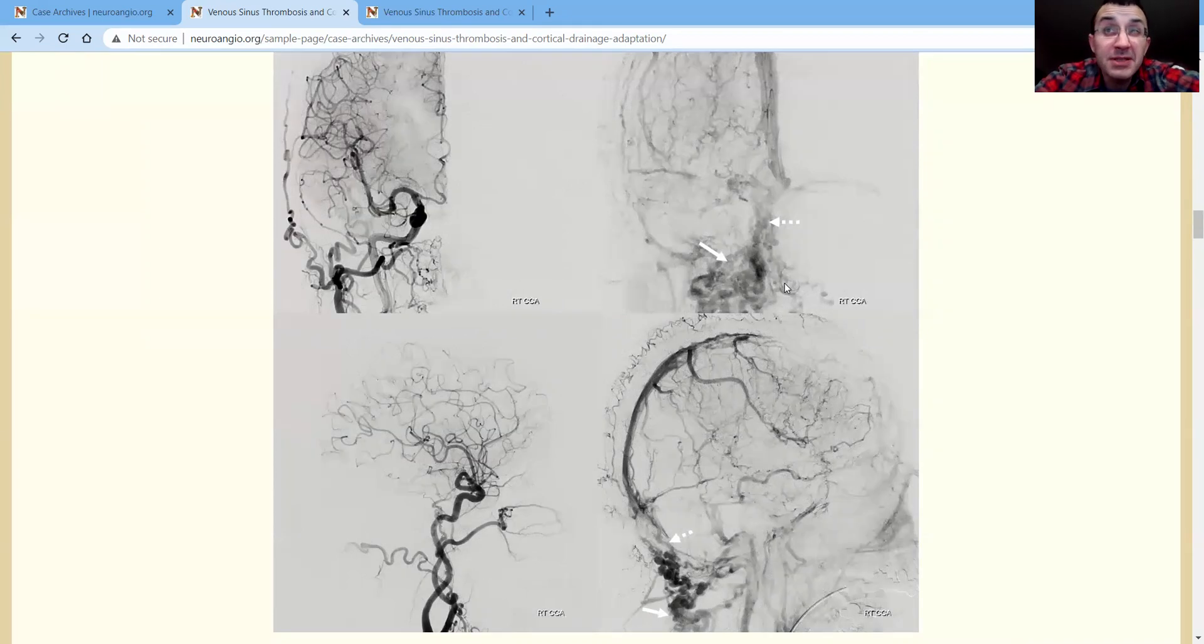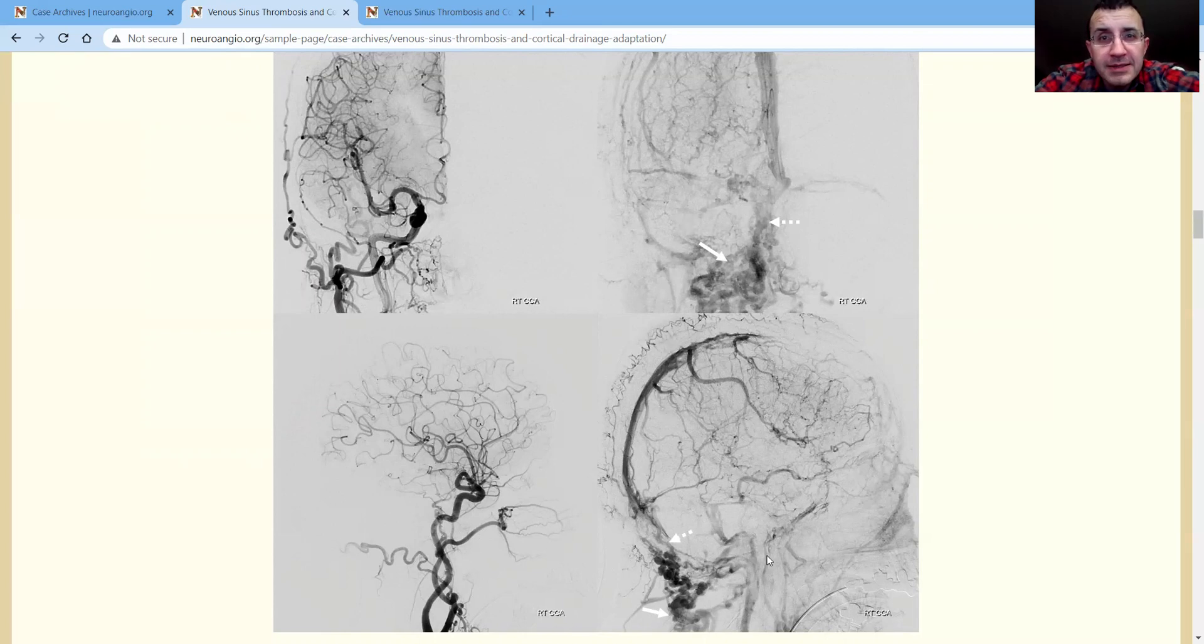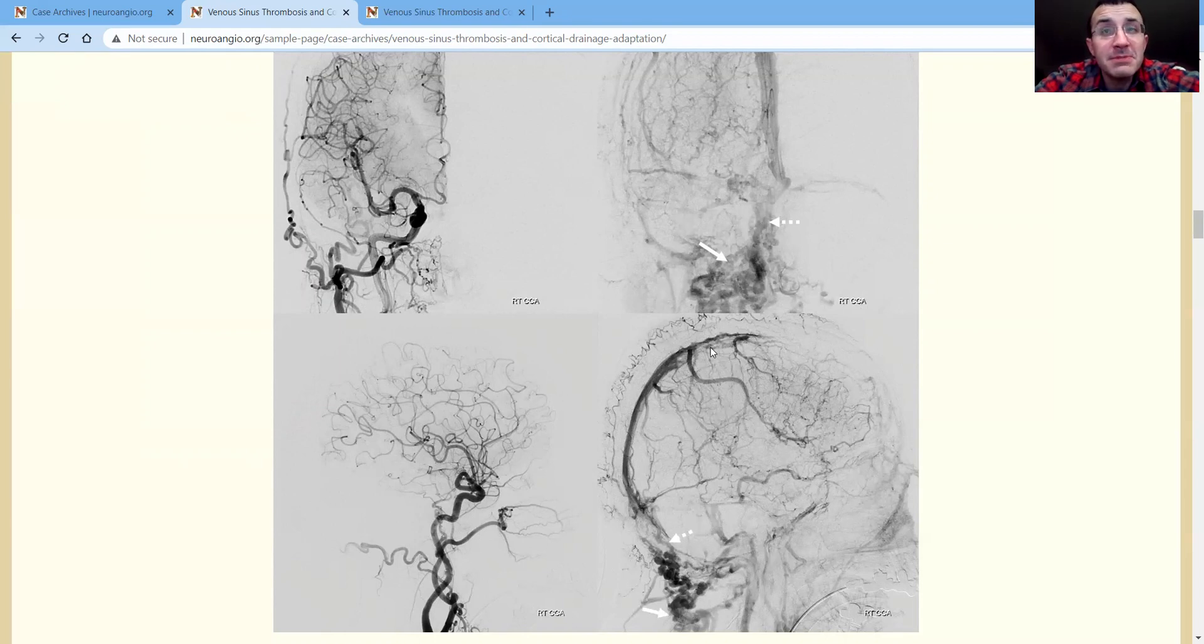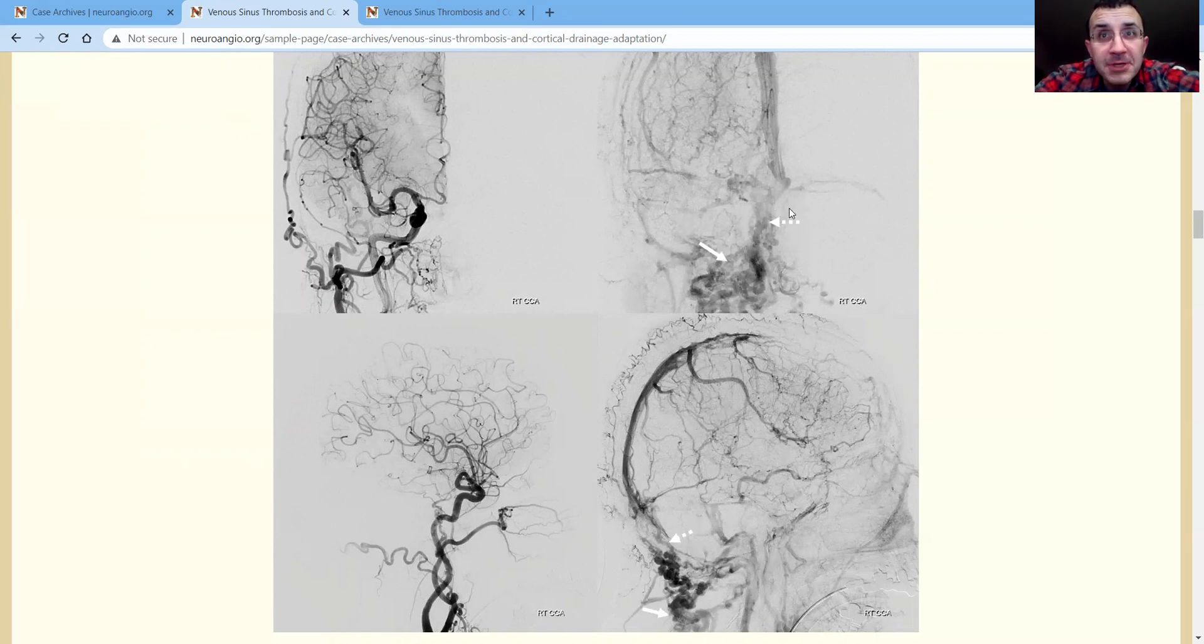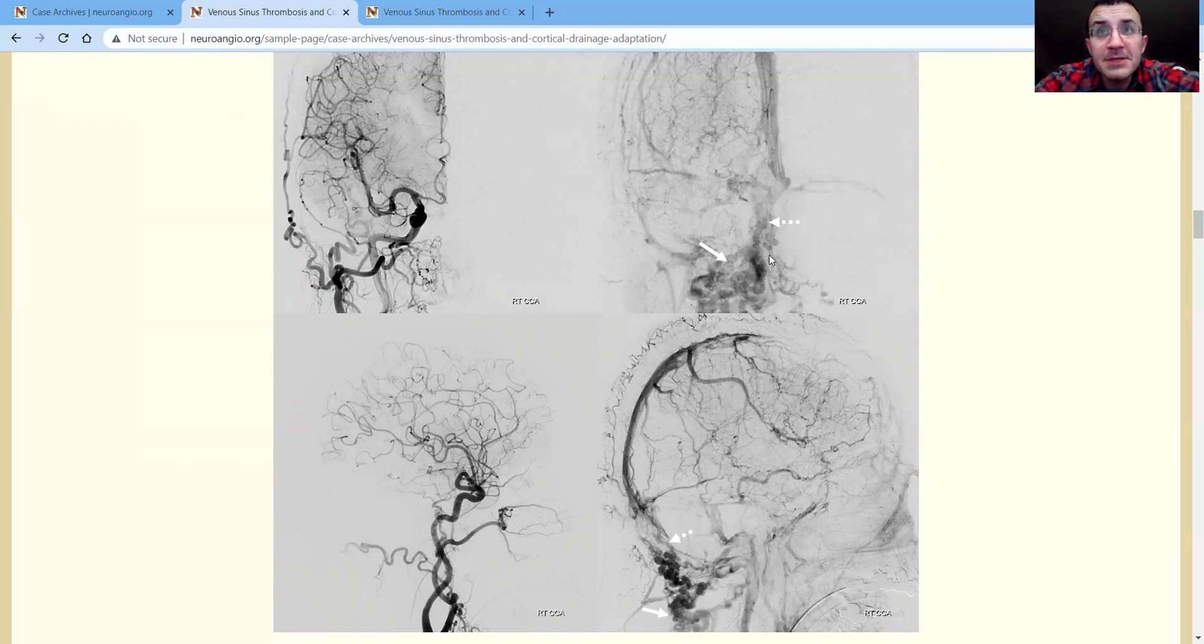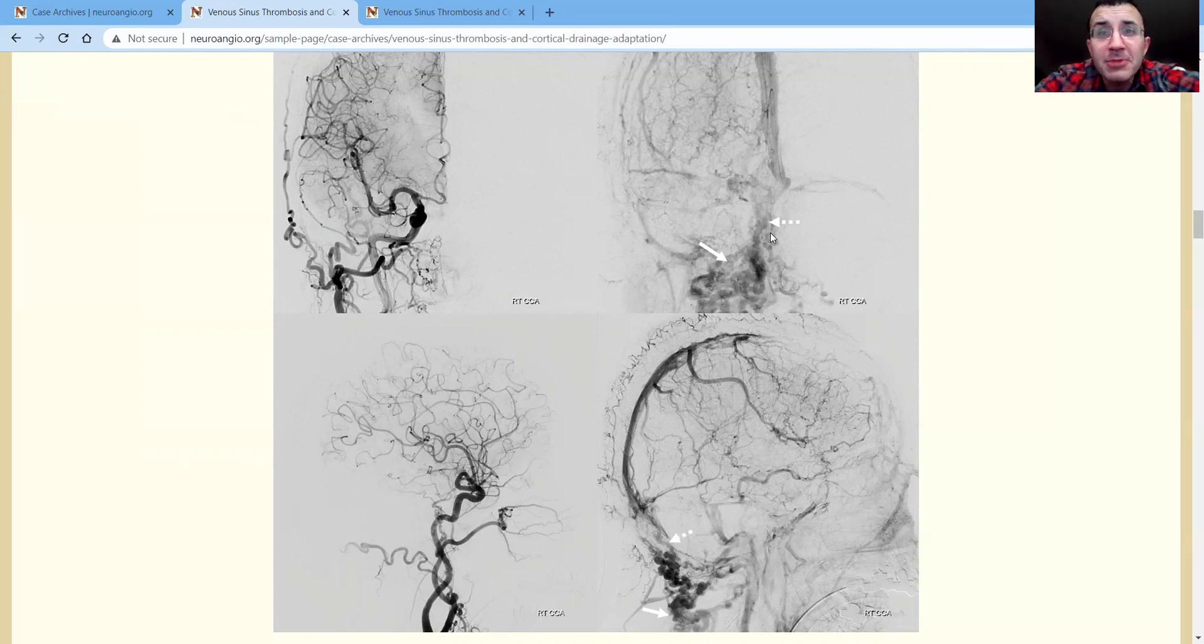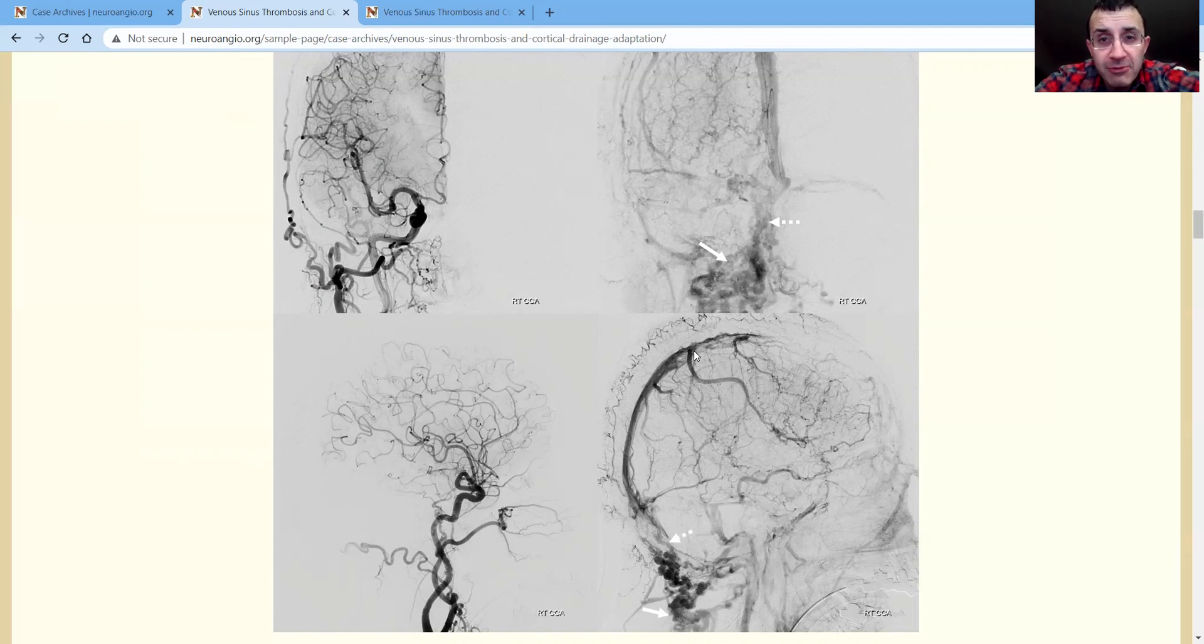Now, how does the blood get to that? It gets there via this emissary vein. There are oftentimes emissary veins. All of these things are covered in different pages of this website. Right here, you see this connection. You see often below the torcular, probably related to the occipital sinus, there's often a little vein, a little hole, an emissary vein here. There's usually one in the sigmoid area too. So you can see this right here. That's the arrow pointing to this vein. You see it's a small, not a big hole, but you see how much it's doing. It's a tremendous augmentation of what can happen, especially on the venous side.